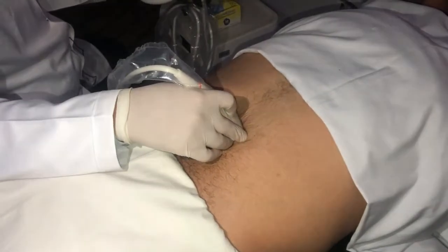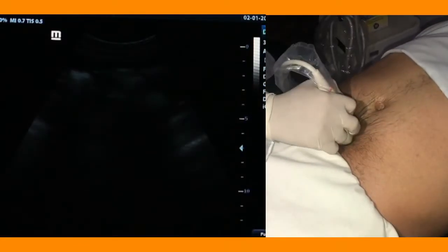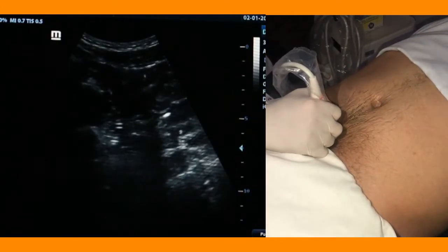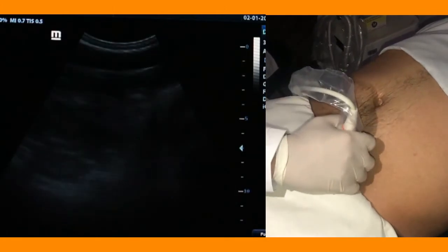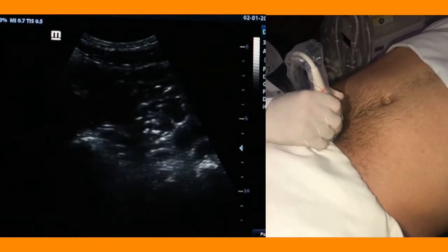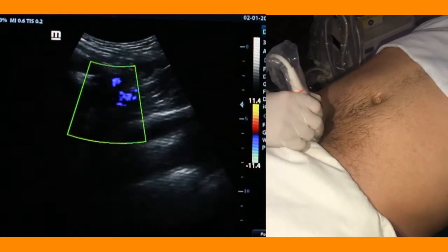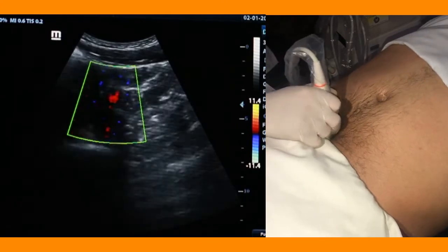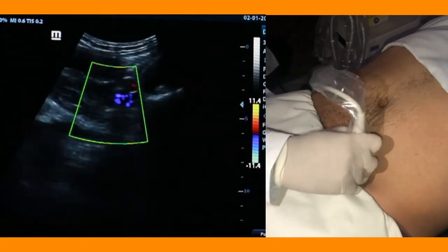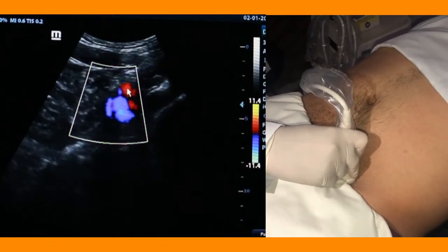One more issue: you can directly go back to check if there is any aneurysm in the external iliac vessels, either left or right. This you should examine. Here are the vessels. You can check the vessels like that. Both iliac vessels are good. Now there is no aneurysm here on the right side, and on the left side also, by the transverse angulation downwards, angulation upwards, all vessels are running well. This is the arterial and this is the venous.